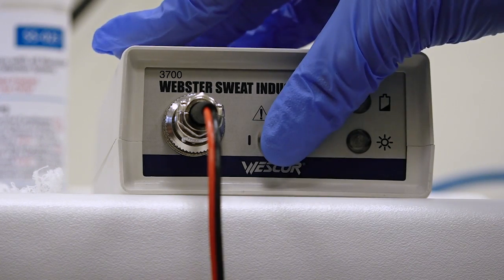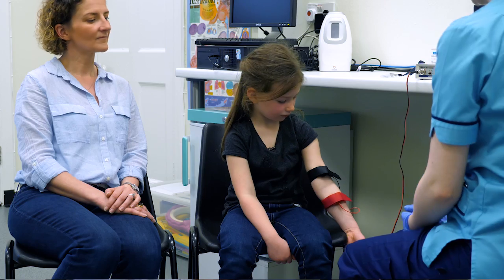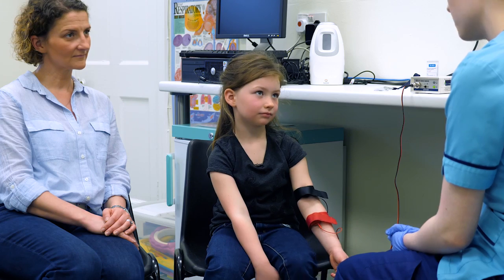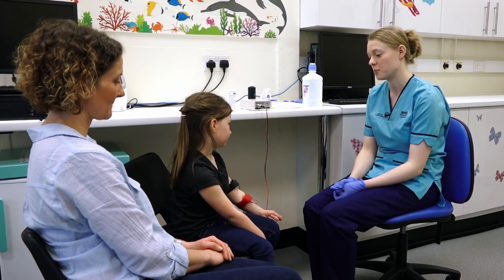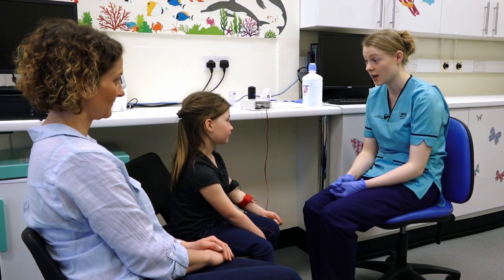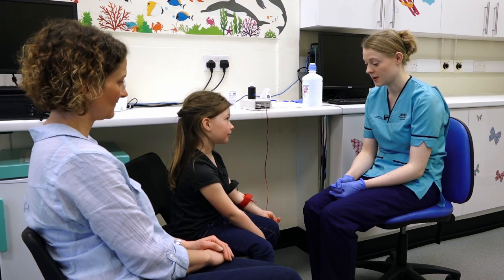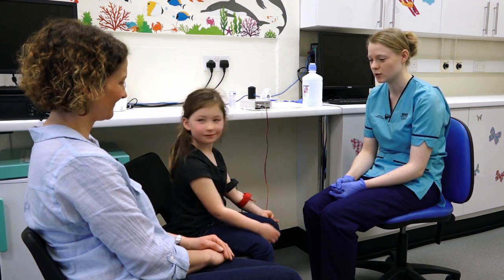Now we're ready to start the machine. It might feel a wee bit warm and tingly. So we've put these on your arm to make your arm sweat and they just need to stay on for about five minutes. How does it feel? It feels a bit strange and tingly. But it doesn't hurt? No. Good.